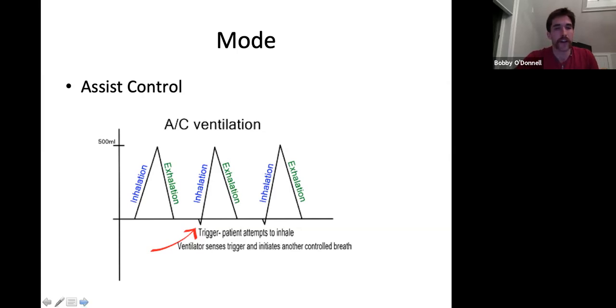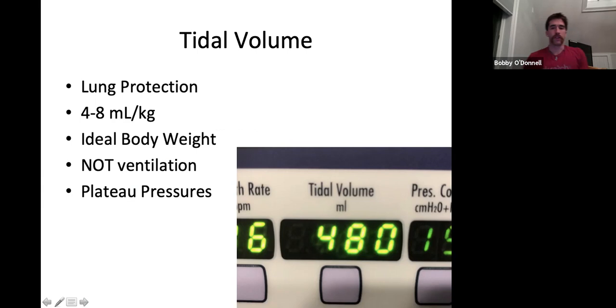So there's a billion buttons on the vent. There are really four main concepts that I want to go over. That's our tidal volume, our respiratory rate, our flow rate, and then our FiO2 and our PEEP work in conjunction. If you don't remember any of the other settings, it doesn't matter. And that's what Dr. Weingart talks about in his Dominating the Vent lecture. These are the big take-home points.